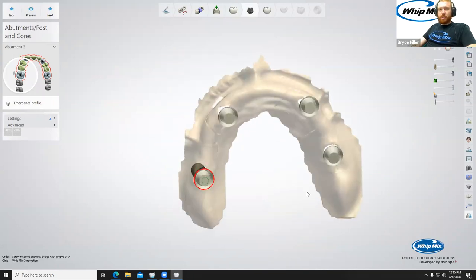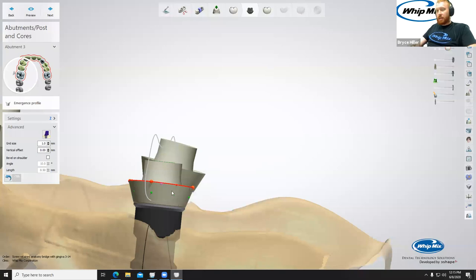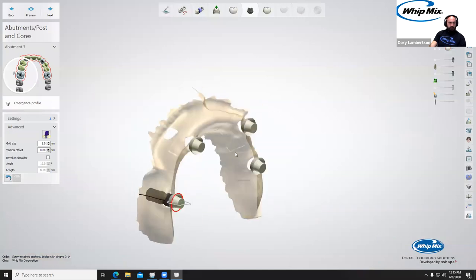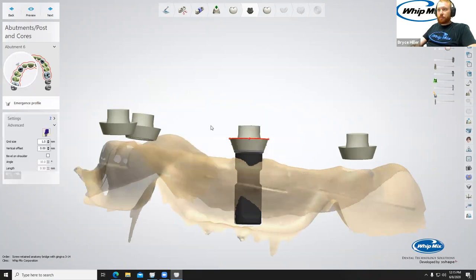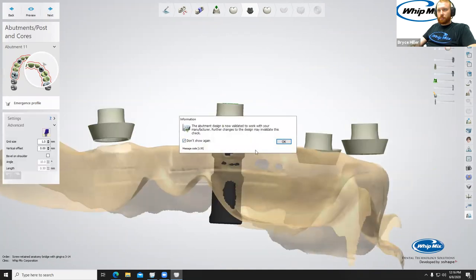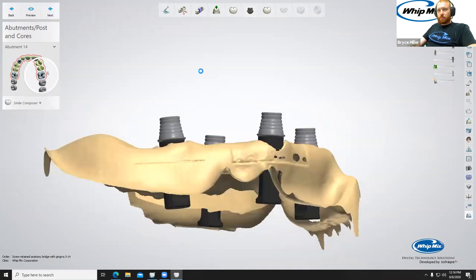Moving through the emergence profiles step — Bryce isn't spending much time here since there will be gingiva and sculpting anyway. This works just like any other screw-retained restoration: you can change your emergence profile and it creates a protected surface below the margin area. Later during sculpting, you can turn on the 'sculpt on protected surfaces' option to modify those areas. Clicking next to move on without worrying too much about these settings right now.